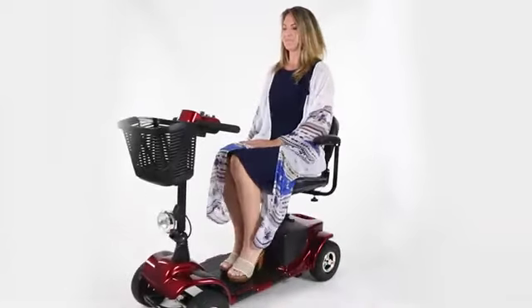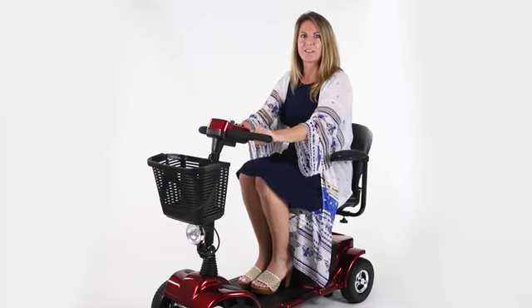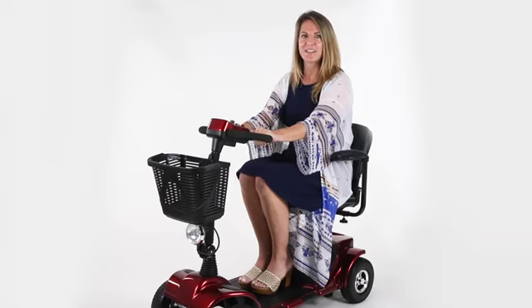Its padded swivel seat will also keep you comfortable, easing back and hip pain. Our Series A 4-wheel mobility scooter is the perfect scooter if you're looking for confidence, navigation, and performance.